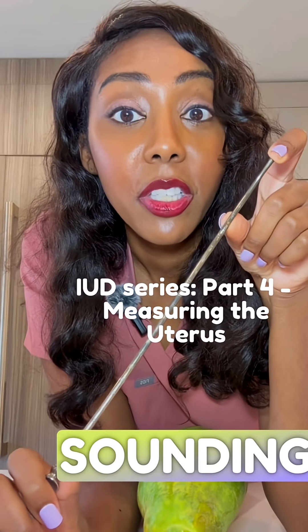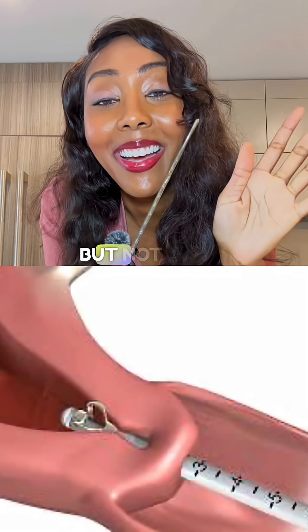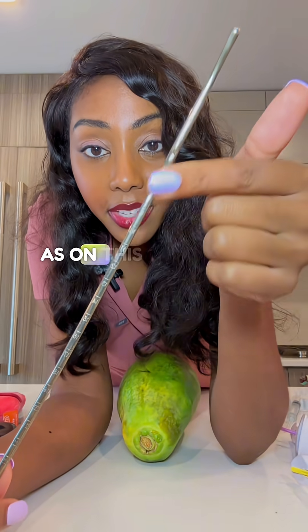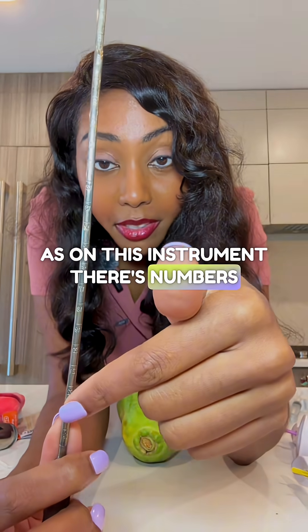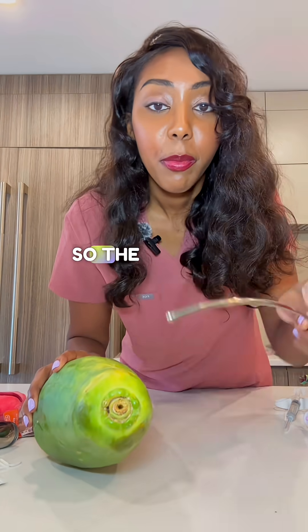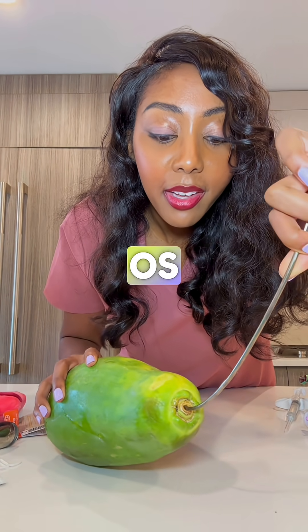The next step would include sounding the uterus. This step helps to measure your uterus, but not every provider does it — I actually often skip this part as well. On this instrument, there are numbers, and this allows us to see how long the uterus is. The provider will put the sound through your cervical os.